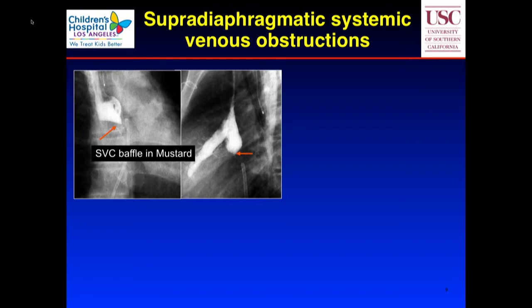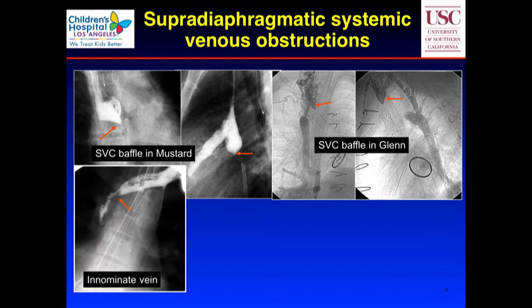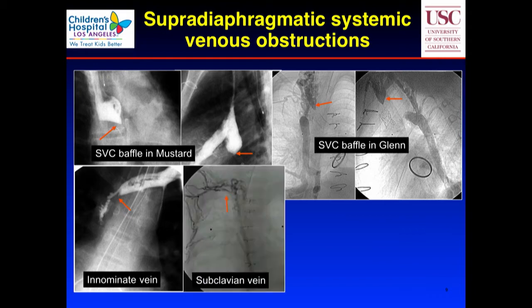That's where the obstruction is. Again, you see how the blood here can't make its way down into the heart, so it goes back through this other large vessel heading down posteriorly. Again, here's an innominate vein. This is the blood that's draining from your left arm that's getting back to the heart. See how it's almost totally gone. So you can imagine that the blood from the left arm is going to have a hard time getting back to the heart, and it'll swell up.